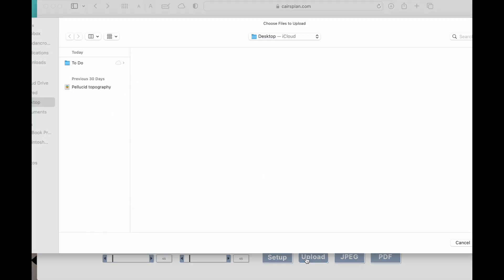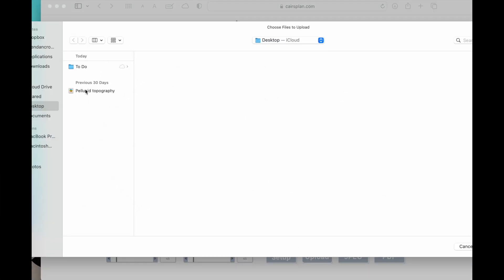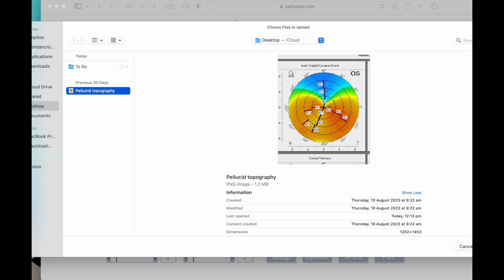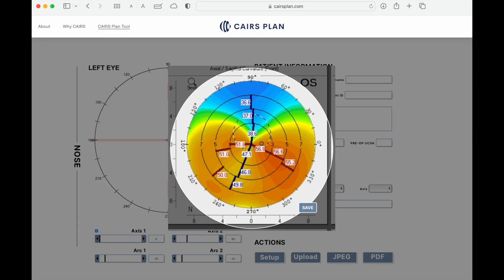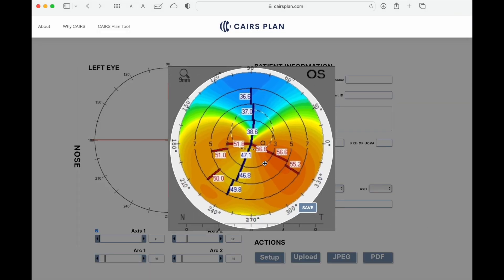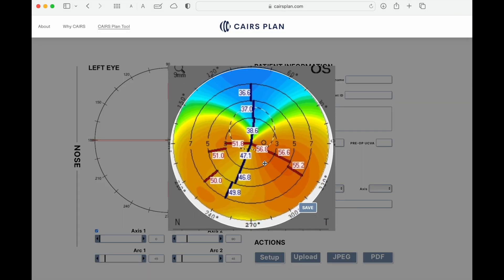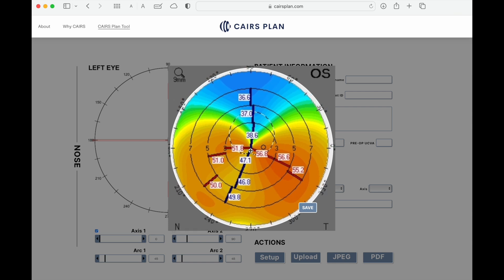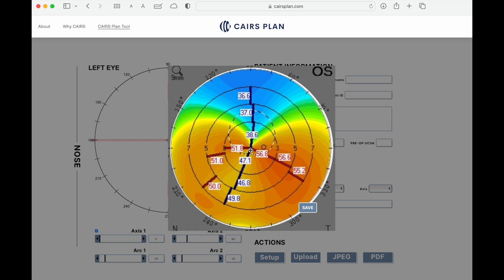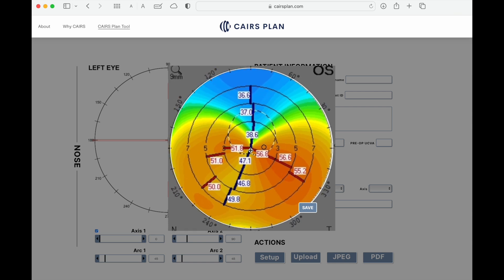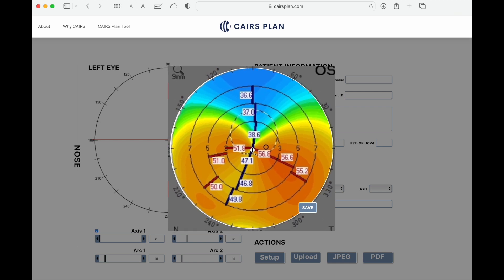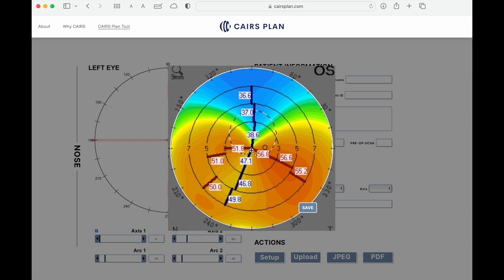Once you've gone to the website, click on the upload button where you can easily upload a JPEG of your topography. The site allows you to zoom in and centre your topographic map. Once you are happy with the centration and magnification, press the save button. This will take you back to the planning page.